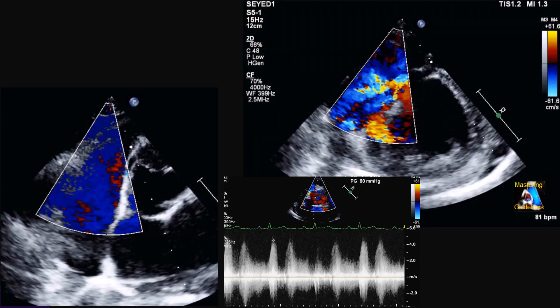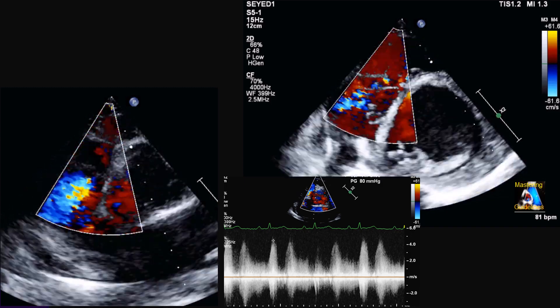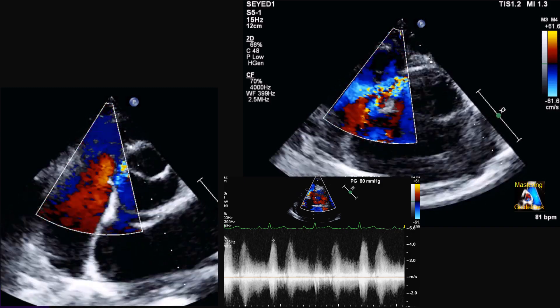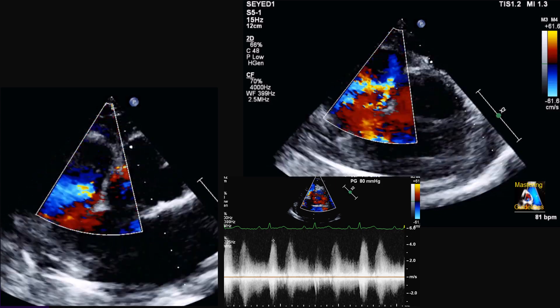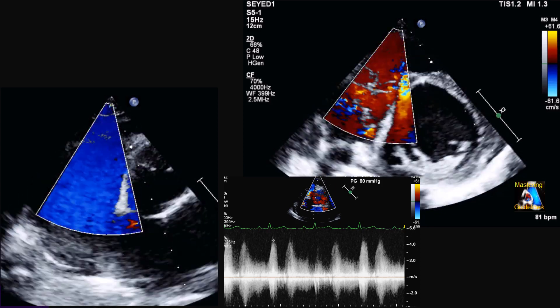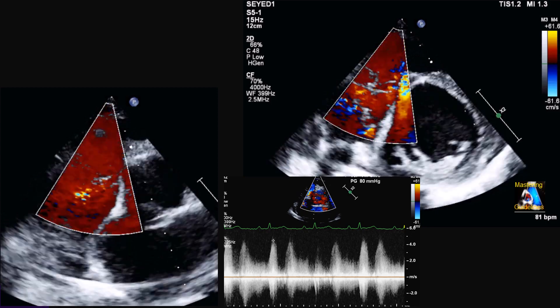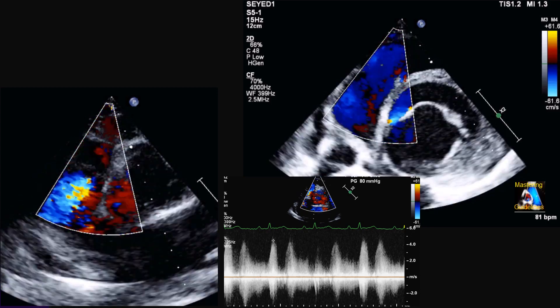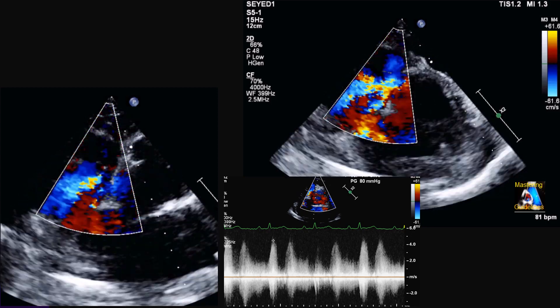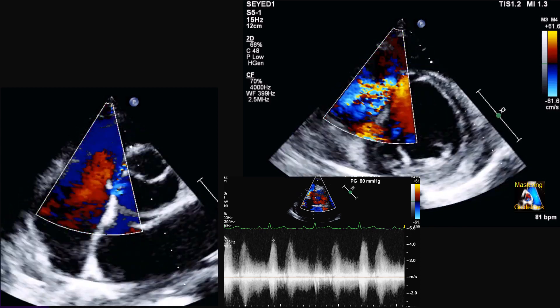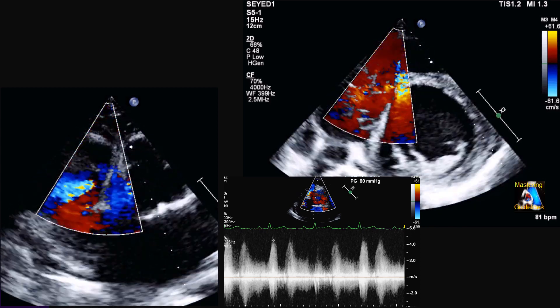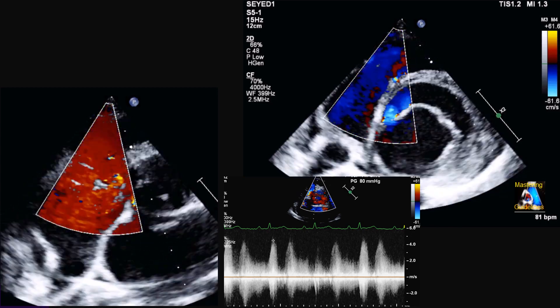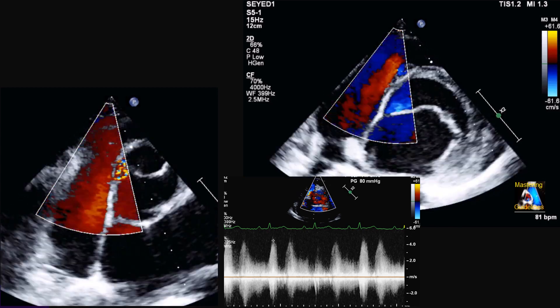Here we have another case. As you can see, at different levels we have color Doppler and continuous Doppler. What is the most probable diagnosis? Is it MR, TR, or something else? Besides the abnormal color Doppler finding — which you can name — do you see any other abnormal finding in this case?